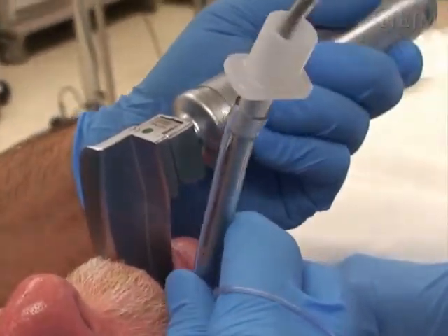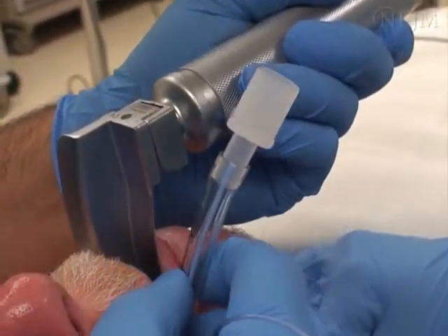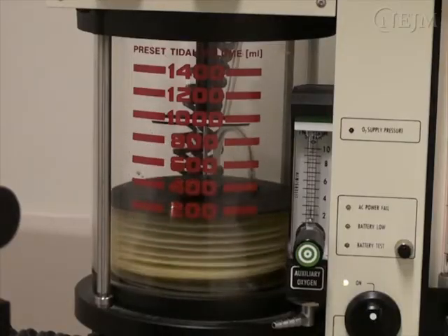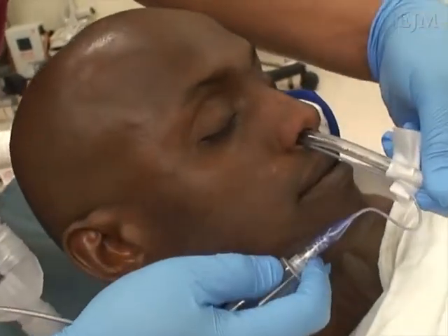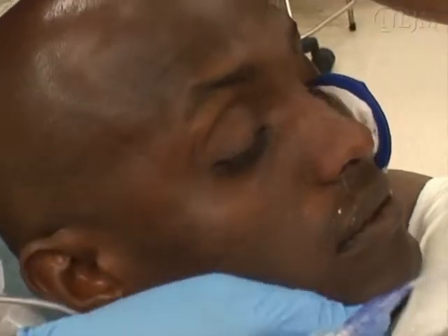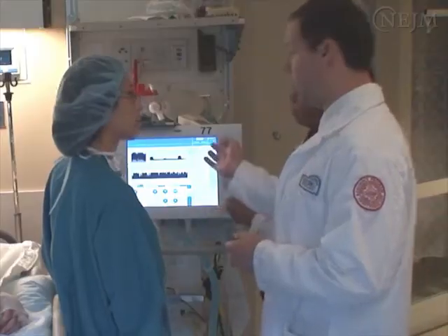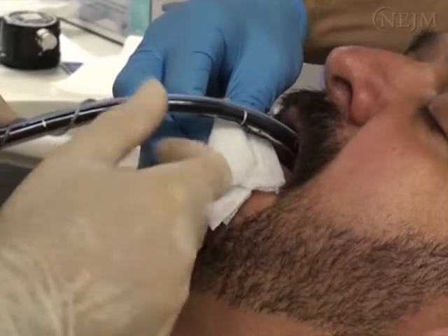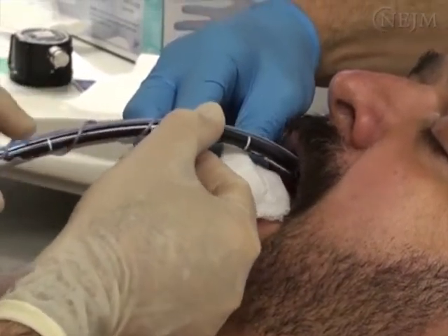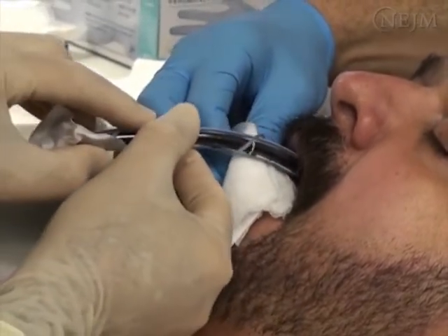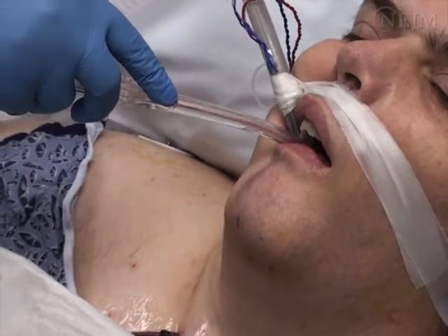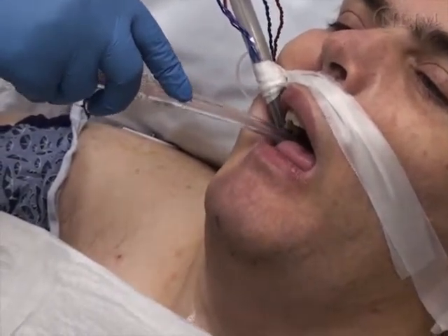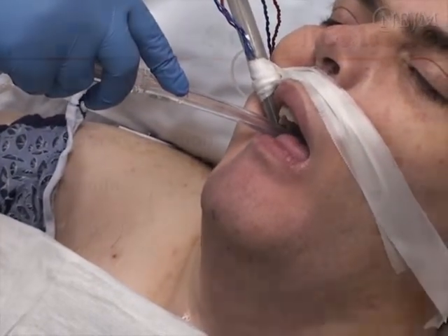Endotracheal tubes are initially placed to secure an airway for the administration of anesthesia, to provide airway protection, or to provide positive pressure mechanical ventilation. Once endotracheal intubation is no longer needed, extubation is indicated. However, the decision to extubate a patient must be made carefully, particularly because respiratory and airway-related complications are more likely to occur after endotracheal extubation than after endotracheal intubation. Although many problems related to endotracheal extubation are minor, serious complications can arise.